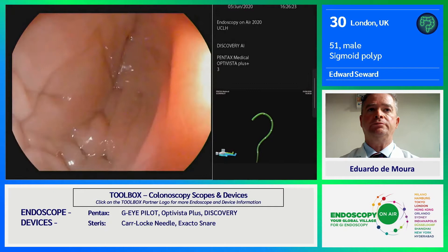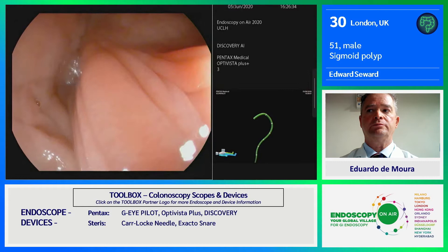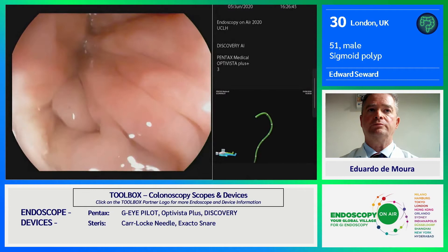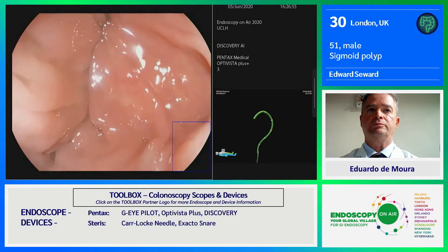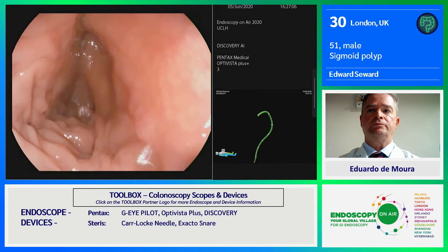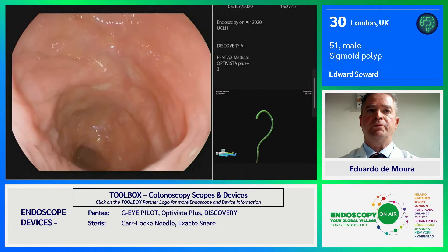We've got the Optivist processor, which is giving us these beautiful images, which we know are really important for adenoma detection and characterization. Most excitingly, we're using the Discovery AI tool. You've seen a lot of AI demonstrated in the colon already today, so this is the Pentax version — a very impressive piece of equipment. Approximately 288 patients with about 800 polyps producing around 100,000 images were fed into the AI to train it. The majority of the polyps were small sessile lesions, so we're hopeful it's able to detect those polyps that often defy detection, even by an experienced endoscopist.